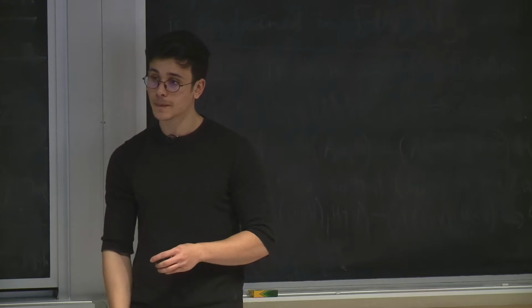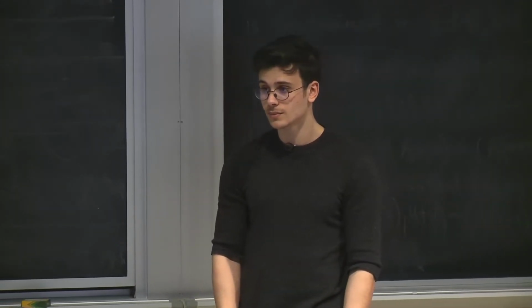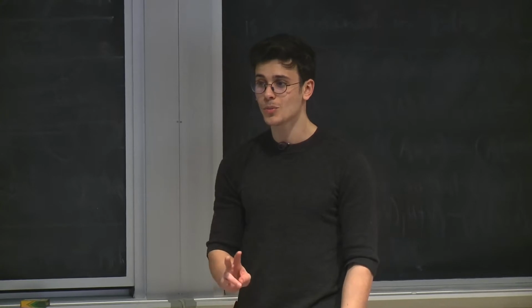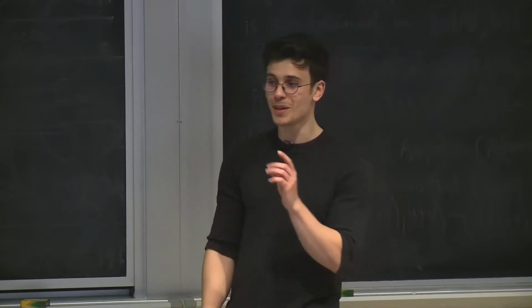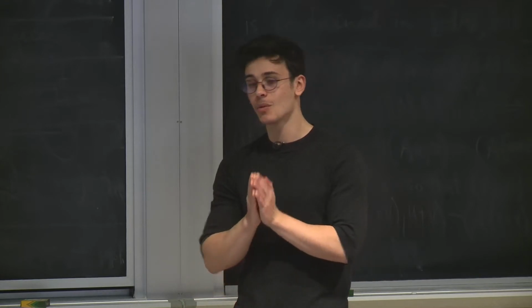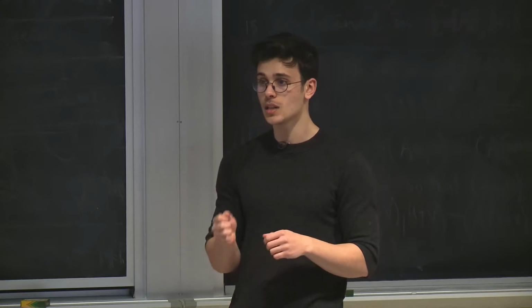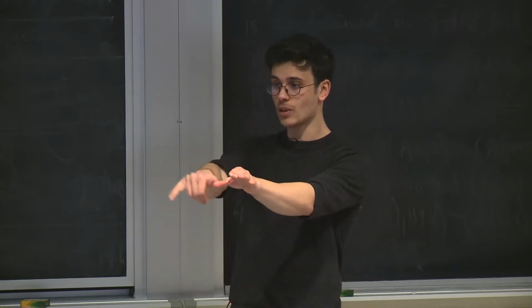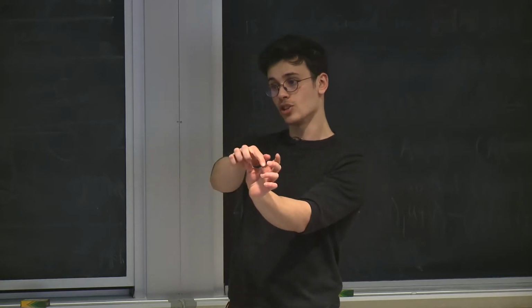Yes? With the adversarial, just to understand, do you let a discriminator predict the machine and then you train against that? So my answer is going to be two parts. One, it doesn't work as well as I wanted yet, so really who knows. But my best hunch, in terms of what's been done before for other work specifically in radio signals, is they use a conditional adversarial. So you feed the discriminator both a label and the image representation, and you have it try to predict the device to take away the information that's not just contained within the label distribution.